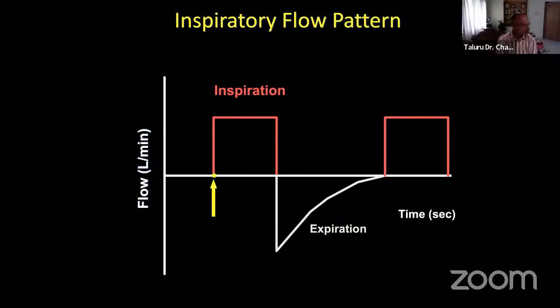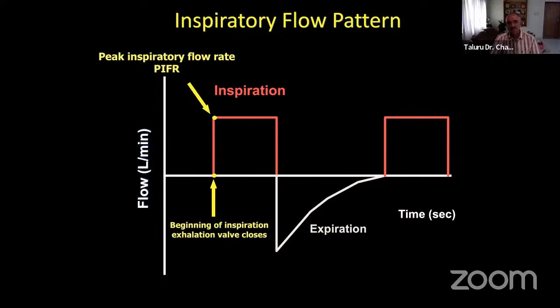When we see, I've said three phases of ventilation: trigger, pressurization, then limiting, then cycling. This is what we understood. So, flow versus time is used to understand modes. That is something we have to understand. This is flow versus time, so everything will be spoken in flows only.